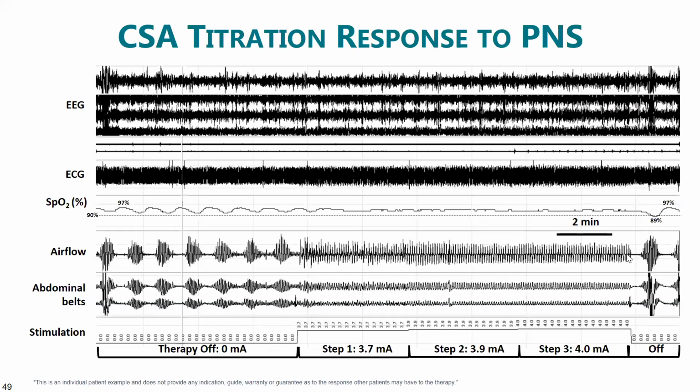Well, that's great, but the moment the patient rouses and goes upright, has Cheyne-Stokes patterns again, at that point, it times out until another couple minutes elapse, and then it kicks in once again automatically. So it allows the patient to get up to use the restroom, but go back to bed, and then within a few minutes, it kicks in and automatically adjusts the intensity of stimulation so as to stabilize the respiratory patterns, as you see here in the middle portion of this panel.